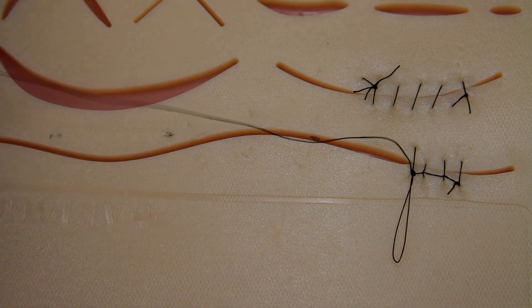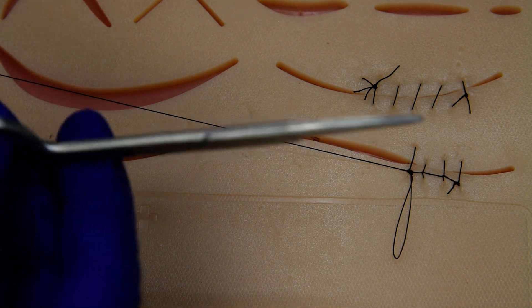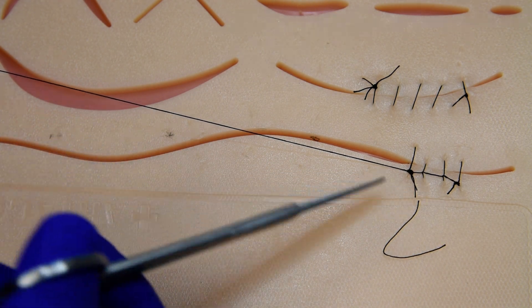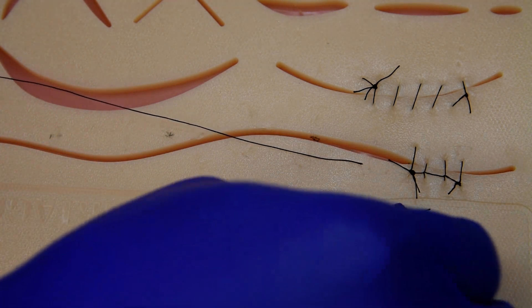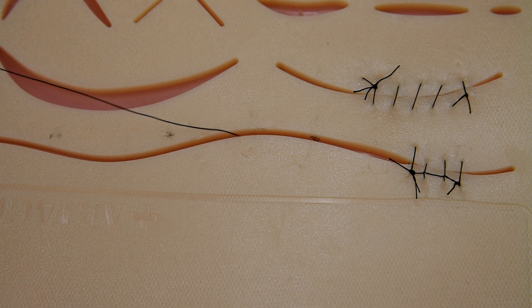So in effect, we have, in this example, four little knots that are a little less likely for the incision to open, compared to the simple continuous with the two knots.